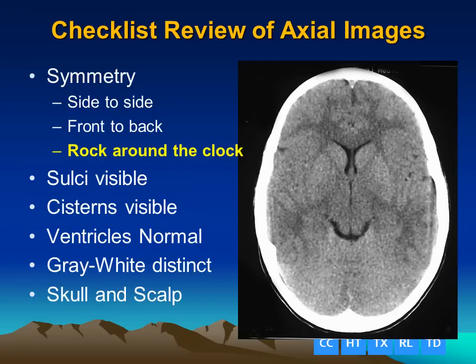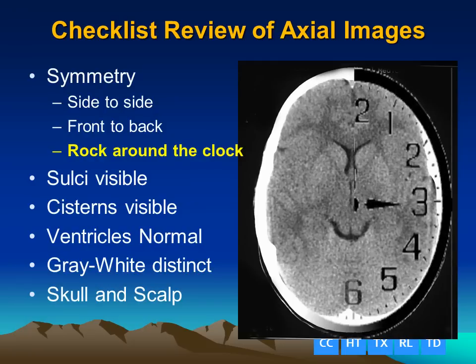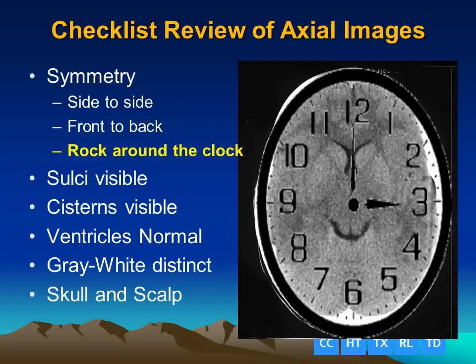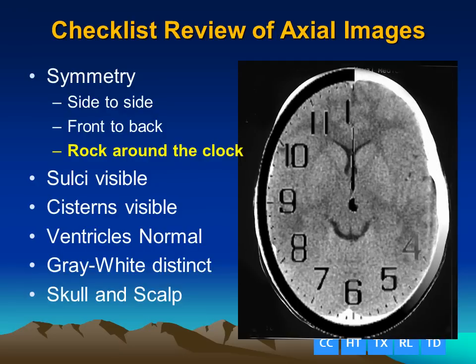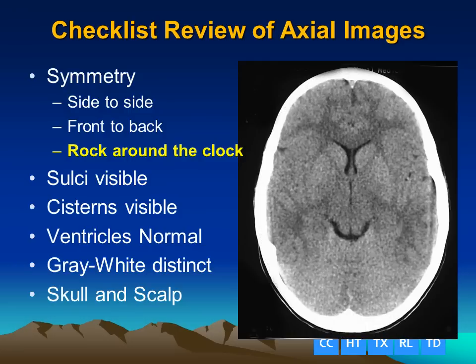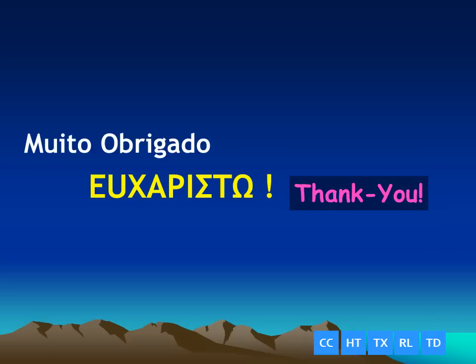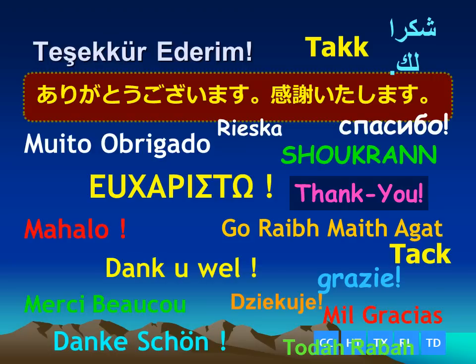In summary, we can look for symmetry and rock around the clock to look all the way around the cerebral hemisphere and make sure that the sulci are symmetric and visible, the cisterns are visible, and the ventricles are normal. Rock around the clock and make sure you don't miss any critical lesions that will cause brain herniation. This has been Jim Smirniotopoulos, and thank you for your attention.